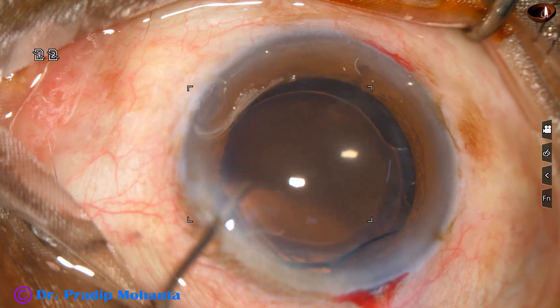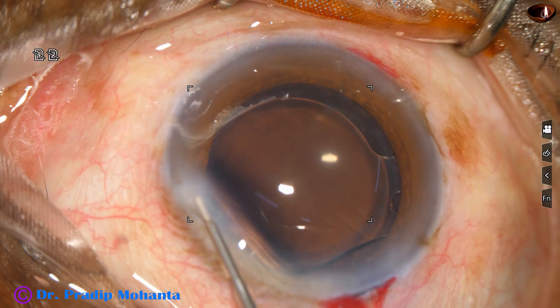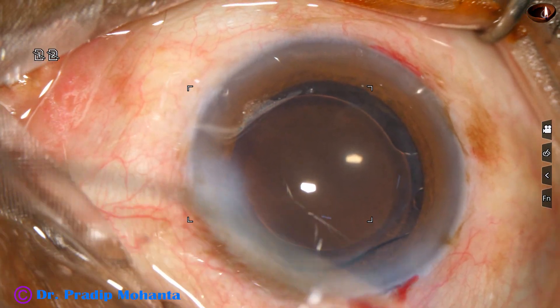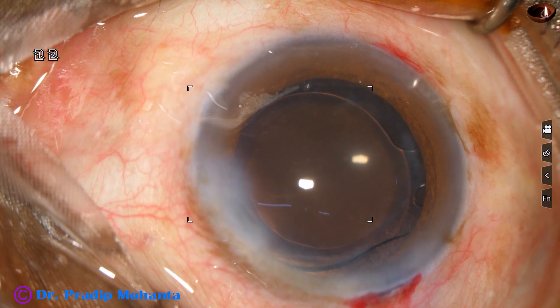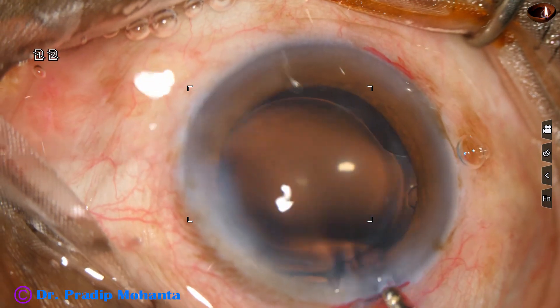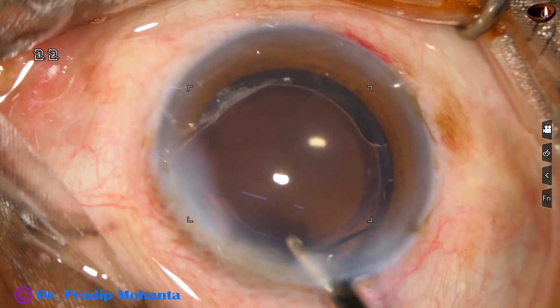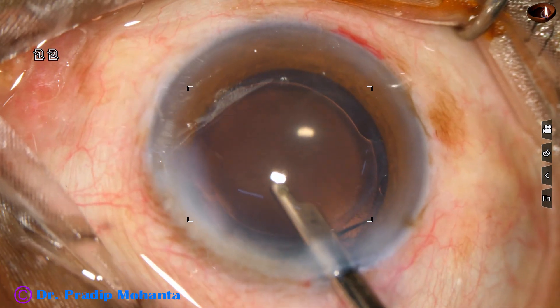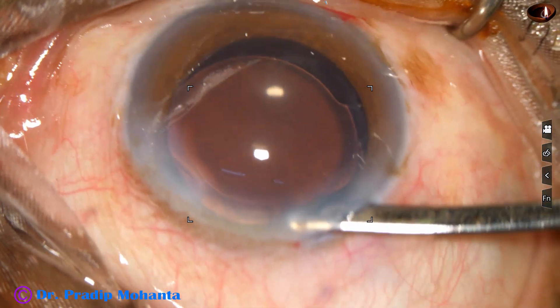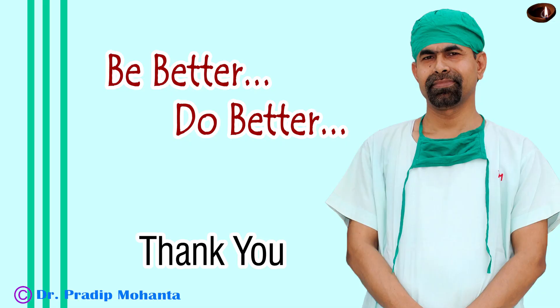This is a bit of moxifloxacin. And now the left side port is closed by hydrating the corneal stroma. The 7 o'clock side port which was posterior to the limbus doesn't need any hydration. The main wound also doesn't require any hydration. The anterior chamber is formed and the case is concluded. Thank you very much for your attention. Hope this video will help you in developing your surgical skills.